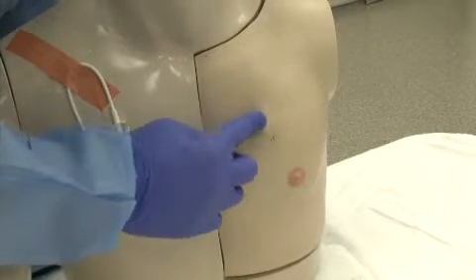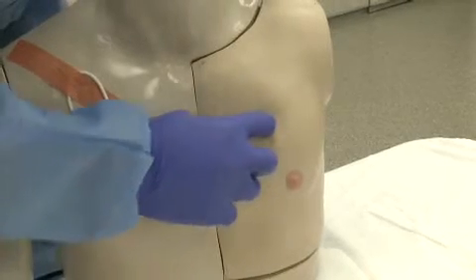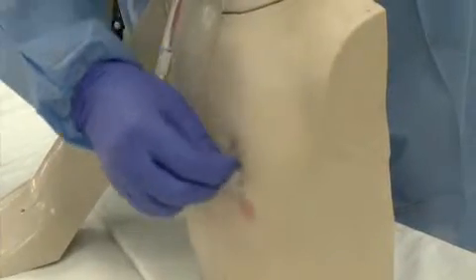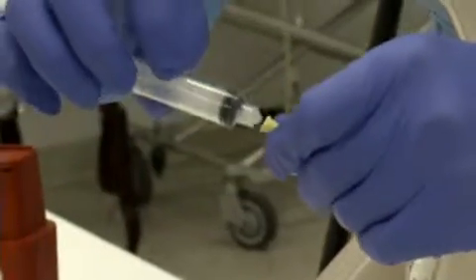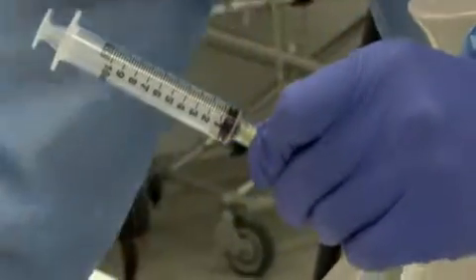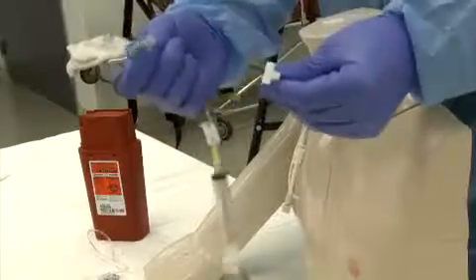Palpate for the IVA port, which is generally located under the skin over the upper chest wall. Cleanse the area with an alcohol swab. Attach the Huber needle to the empty 10 cc syringe and ensure that the clamp is closed. Insert the needle straight into the implanted disc and stop when you meet resistance as the needle tip makes contact with the back wall. The needle pierces a thin rubber membrane in the IVA port, which self-seals when the needle is removed.